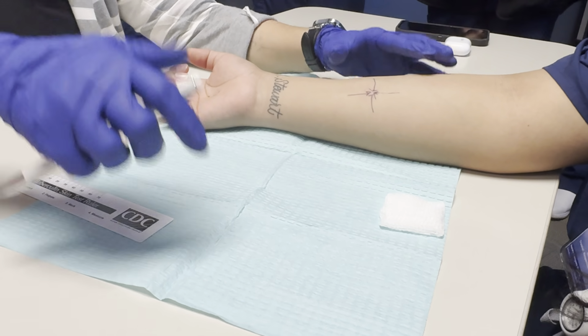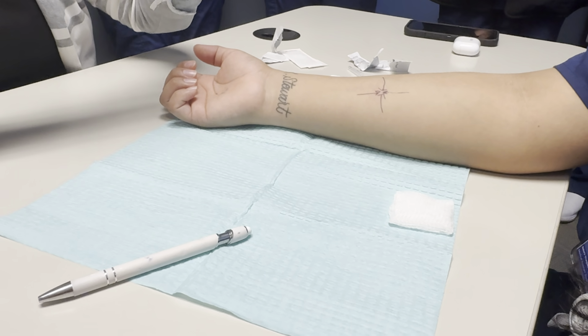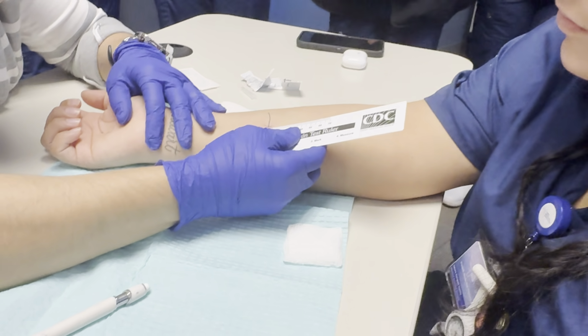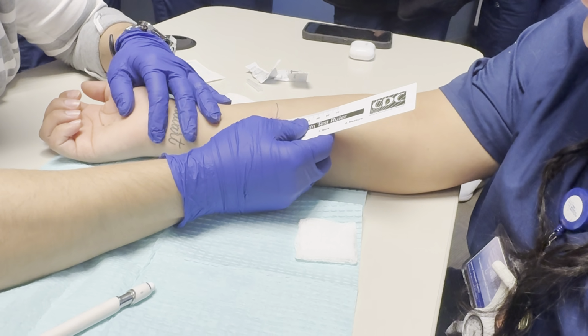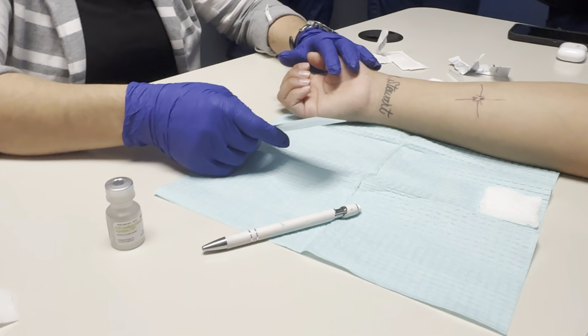Stop right here. Okay, so now what I'm going to do, and each time you use this, please make sure you get an alcohol wipe and clean it, okay? I'm just going to measure this from one arrow, 0 to my other arrow, and that's 5 mm. So what I'm going to go ahead and let the provider know, and we'll go from there, okay?